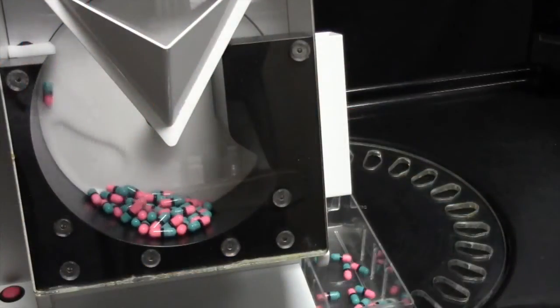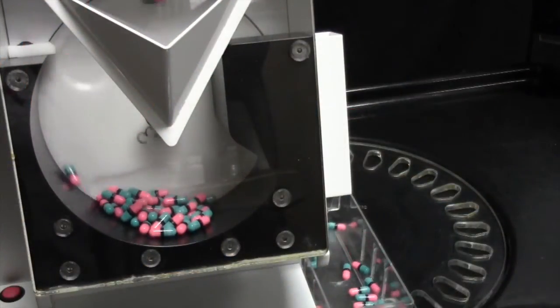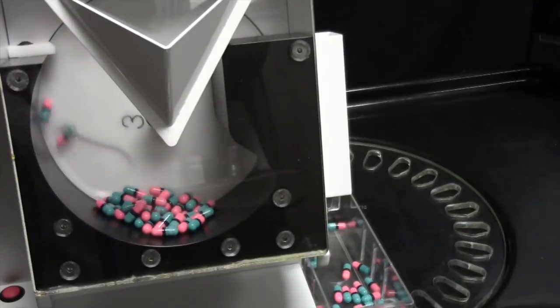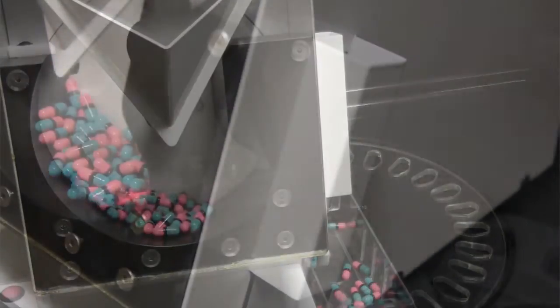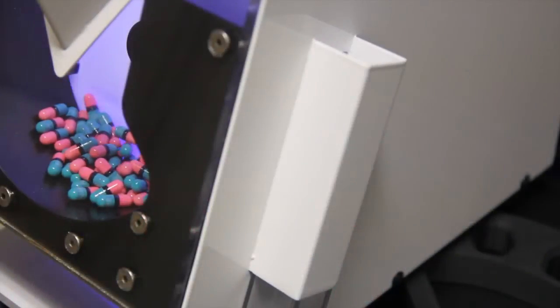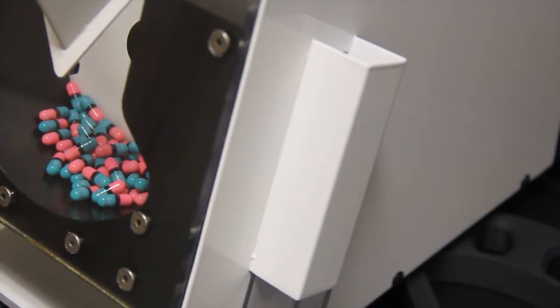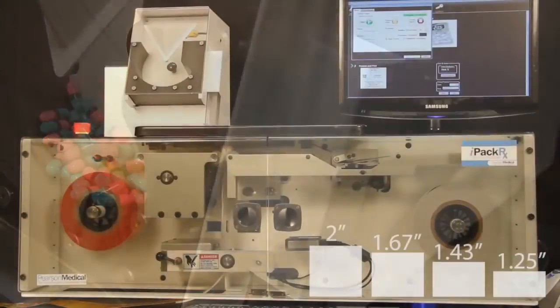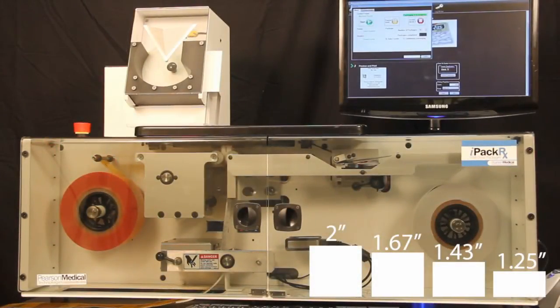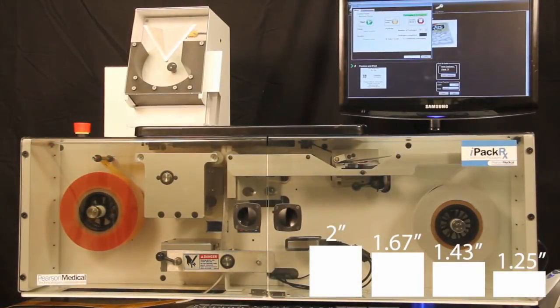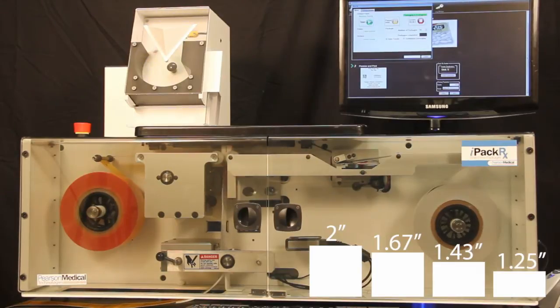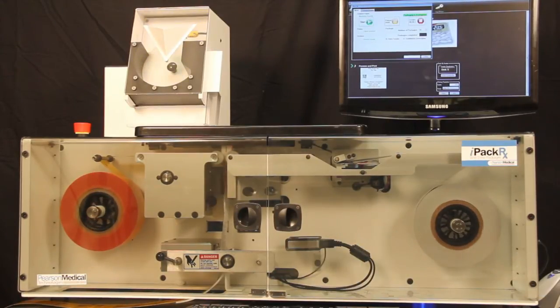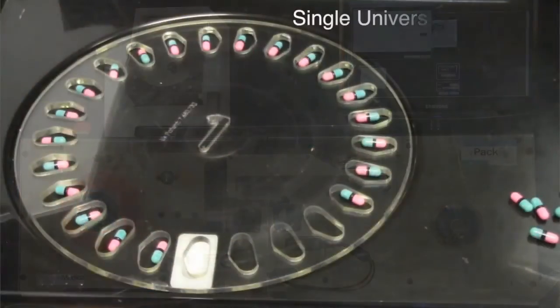Featuring no-crush technology and advanced design, crushed pills are virtually eliminated. The IPAC-RX can produce four different package lengths: 2-inch, 1.67-inch, 1.43-inch and 1.25-inch with a simple mouse click. The single universal feed disk eliminates multiple feed disks.